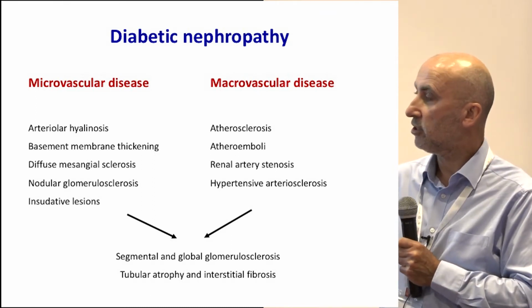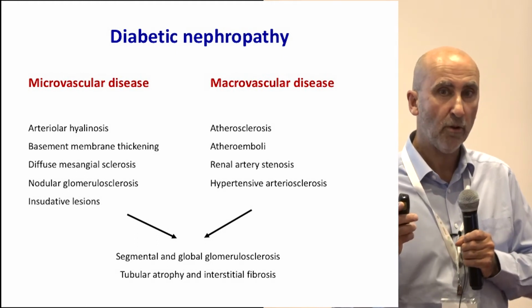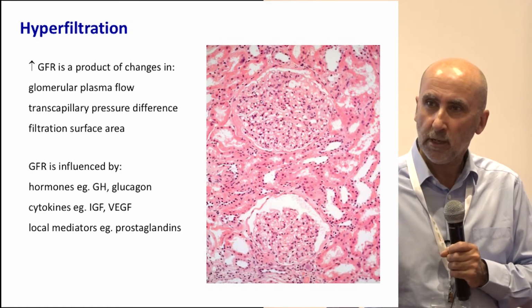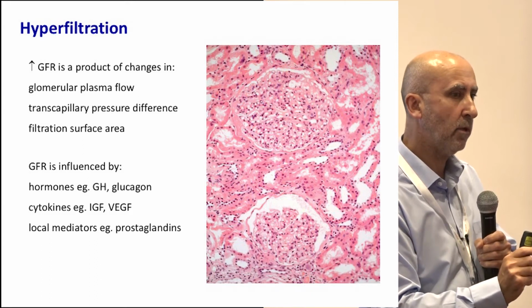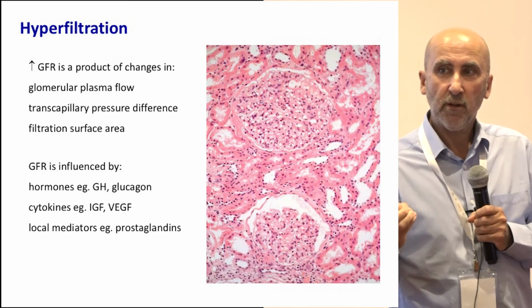When you get down to this stage of advanced atrophy and fibrosis, often the changes are rather non-specific. The earliest changes that your diabetic patients will suffer in their kidneys are clinically silent, and that's the stage of hypertrophy. I'm very familiar with diabetic kidneys in my autopsy work, and they are big. They're usually about 50% bigger than the average person's kidneys. And this also applies to the glomeruli. That is a huge glomerulus. But this doesn't give rise to symptoms.